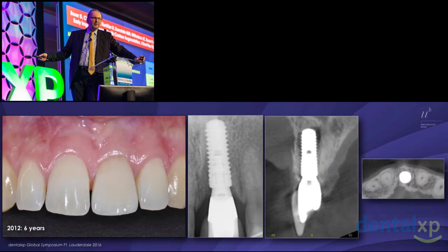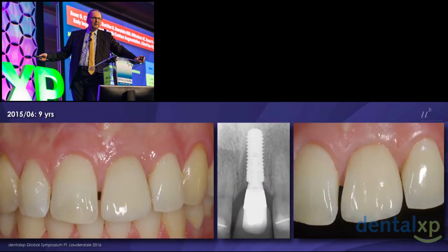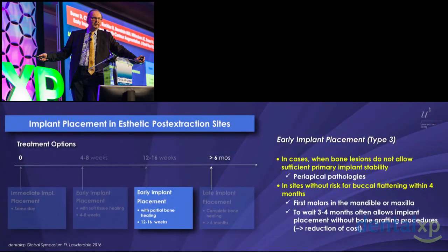And you see here at 6 years the same patient, and I will show you these data in the afternoon. And here you see the same patient half a year ago, 9 years now. So that means we're going to see this patient this year for the 10-year follow-up. And you see radiographically excellent stability. Also soft tissues absolutely stable. Of course, you need a patient who cleans the mouth and takes care of home care, and otherwise it will not be long-term. But that's also the job you have to provide, this maintenance care program with a dental hygienist.